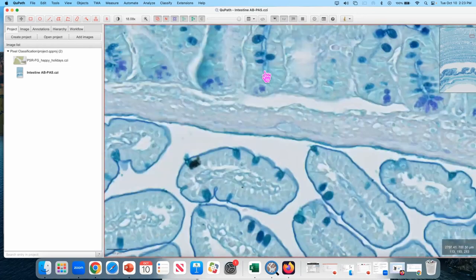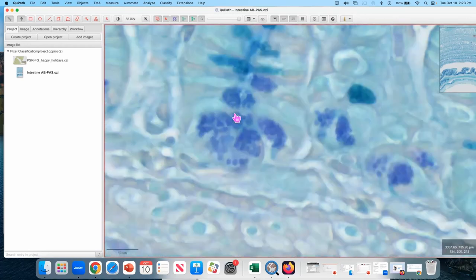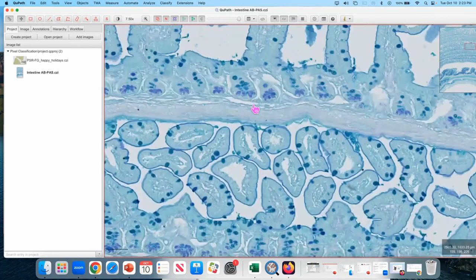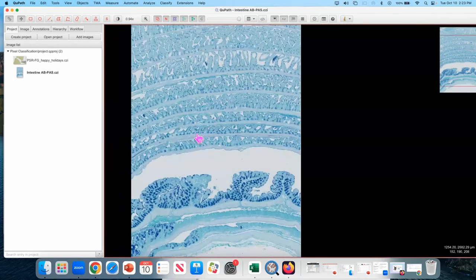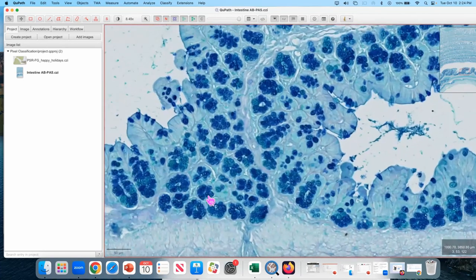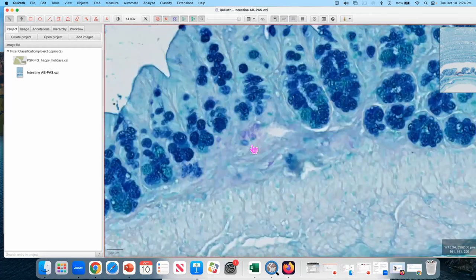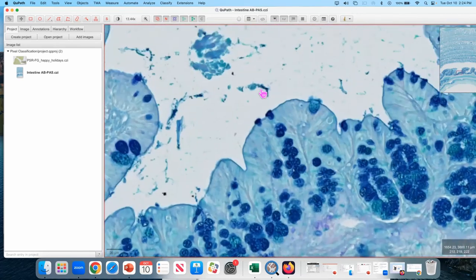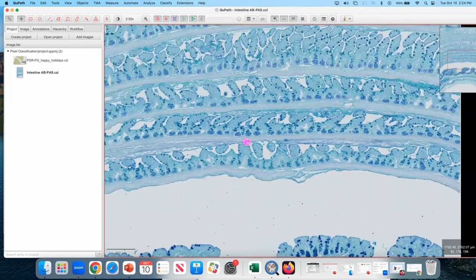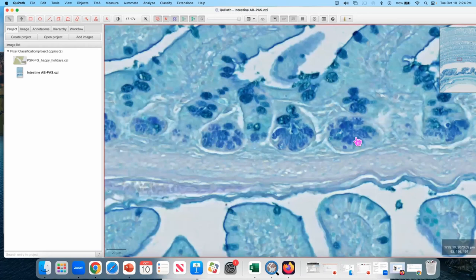Those are intestinal crypts. That's where your stem cells are. And in this area, there are also a lot of Paneth cells. They produce antimicrobial peptides that are important for your overall gut health. And what I like about this image is that it contains some sort of verification for the quality of that staining, because in the colon, which is depicted here, there should be no Paneth cells, okay? So there are no granules sitting at the bottom of the crypts. There might be something that is slightly stained with that other shade, but it's nothing coming close to what you're seeing here, where you have those nicely packed granules inside the Paneth cells.